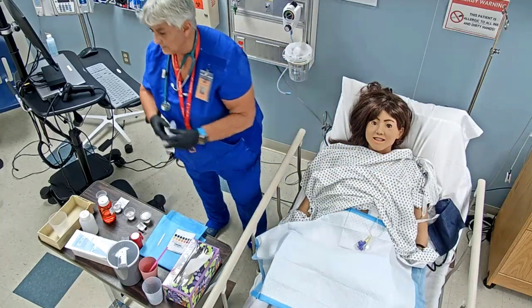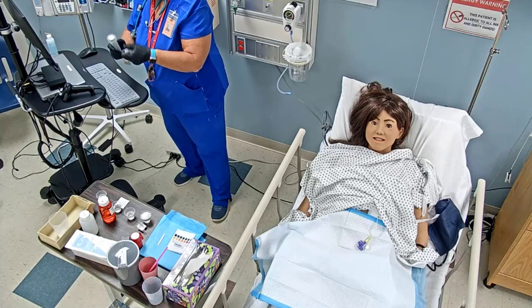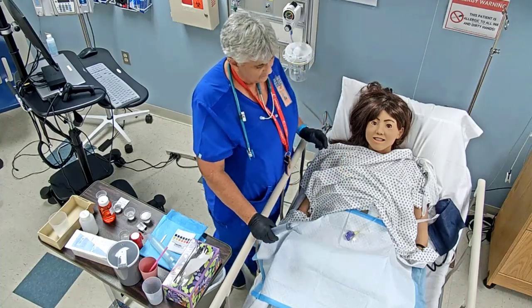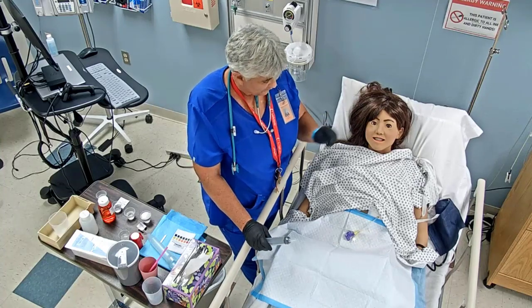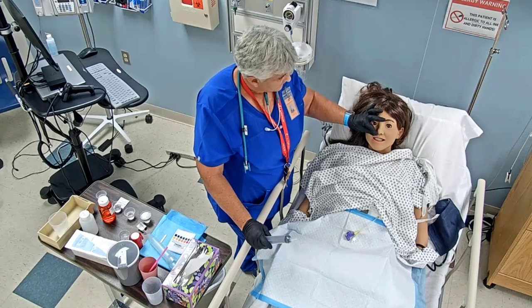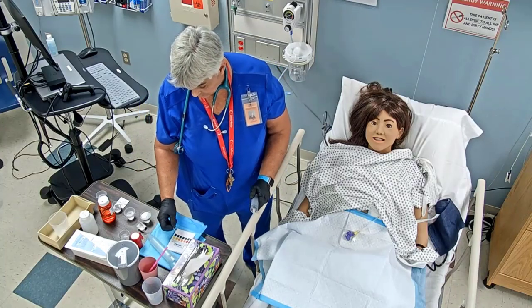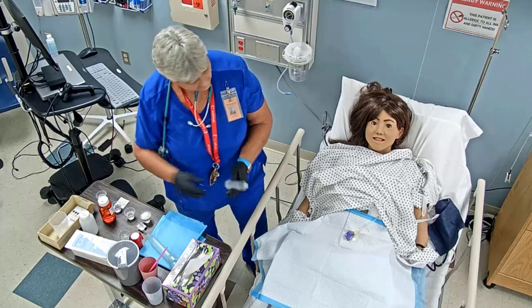All right, I'm going to get my syringe out. Okay, so we've got our medications. Now we've got a couple of things that we need to do right now. If we were doing an NGT, we need to check for placement before we put those meds down. Placement with an NG tube would be looking at the marker at the nose, making sure it's there, and then we would also remove some fluid and double check our pH. On this one, we're going to make sure that it was less than 5.5, okay? So that would be if we were doing the NG tube.